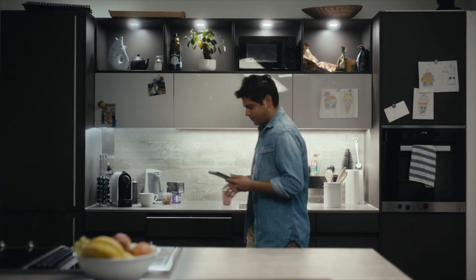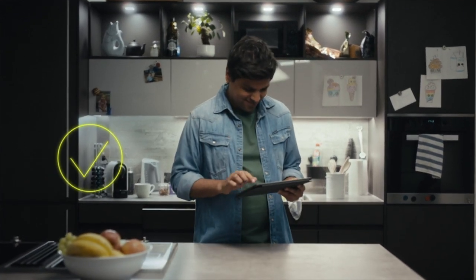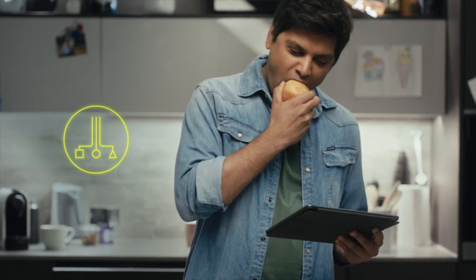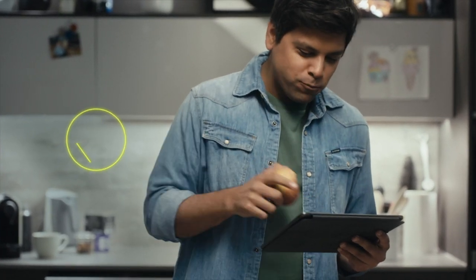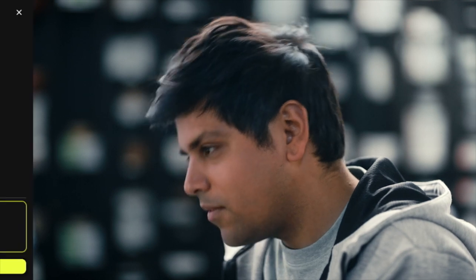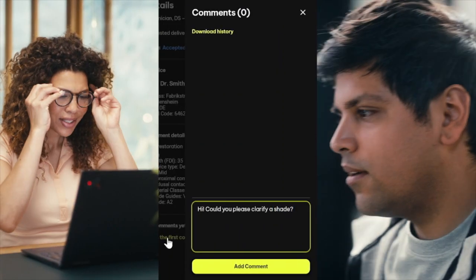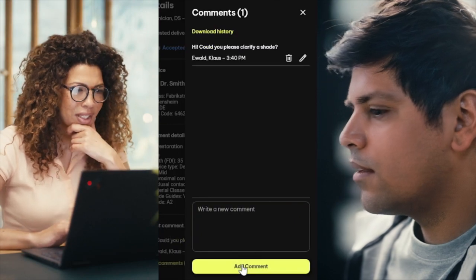Easy integration into your lab setup? Check! Manage your orders easily in one place from wherever you are and whenever you need them? Check! All information for one order at a glance? Done! Questions about an order? Use the integrated communication and collaboration functions with your dentist. Easy!